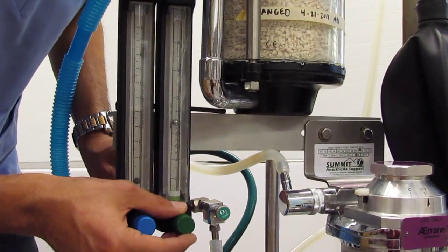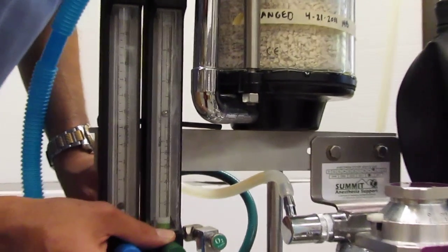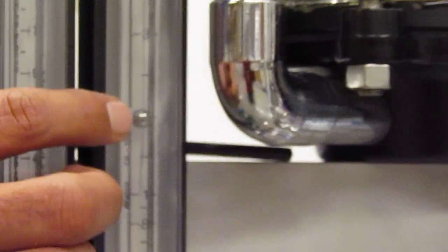Now notice, I know I can read my flow meter via that little ball that's in there and I read the flow meter by where we are in the center of the ball. So right there, I am at two liters of oxygen per minute.